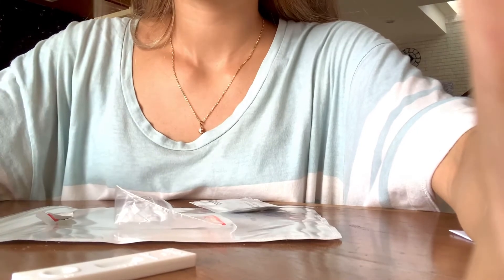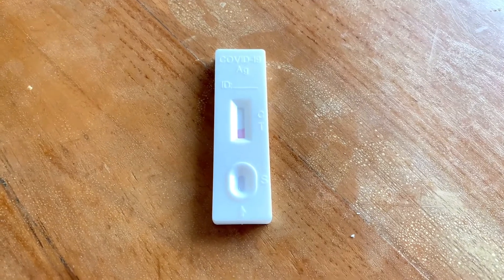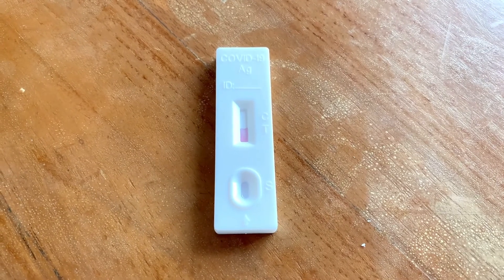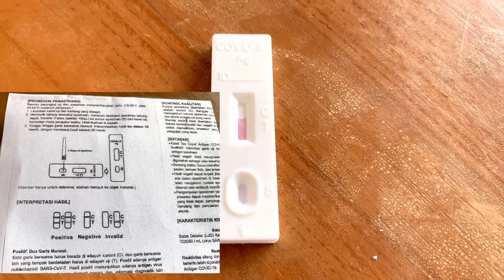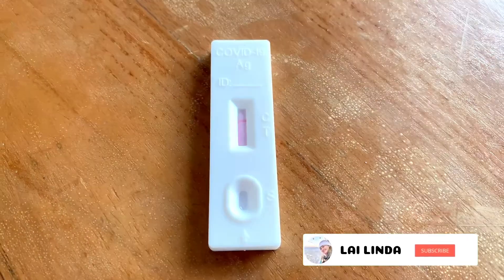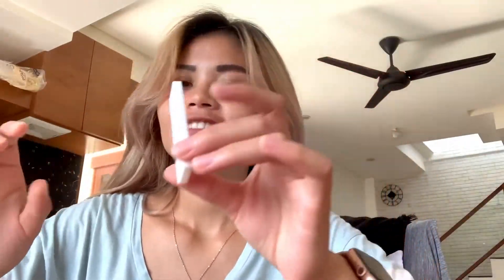Nah, habis itu kita akan tunggu hasilnya selama kurang lebih satu menit ya. Jadi, kalau misalnya hasilnya cuma satu garis berarti negatif, kalau dua garis berarti positif ya guys. Dan kalau misalnya hasil testnya tidak valid, itu dia di T untuk hasilnya. Tapi kalau hasilnya valid, berarti hasilnya berada di C. Oke guys — udah satu menit dan hasilnya negatif. Dia berada di C dan garisnya cuma satu ya guys. Jadi itu dia tadi caranya melakukan tes, dan hasilnya negatif ya.